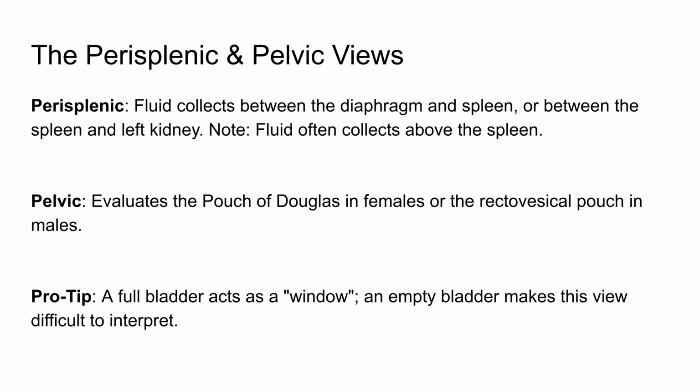In the parasplenic view, fluid collects between the diaphragm and spleen, or between the spleen and left kidney. The pelvic view evaluates the pouch of Douglas in females or the rectovesical pouch in males. A full bladder is helpful for this view.